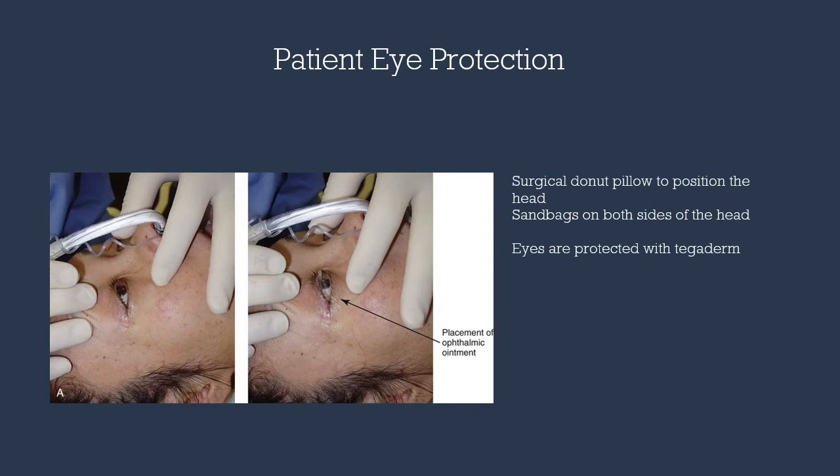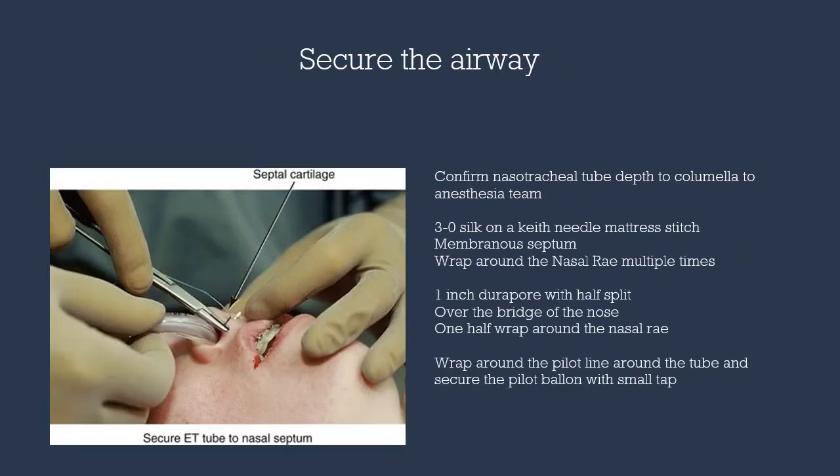Once the patient has been intubated, we want to protect the eyes through application of lateral tapes. Next, we want to secure the airway because head movement occurs during our procedure. We want to confirm the nasal tracheal tube depth with the anesthesia team.